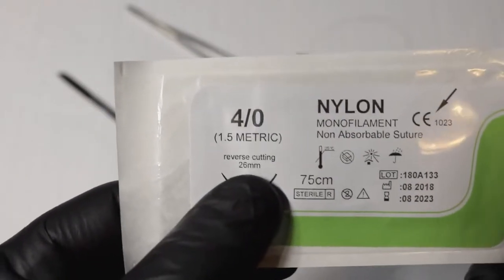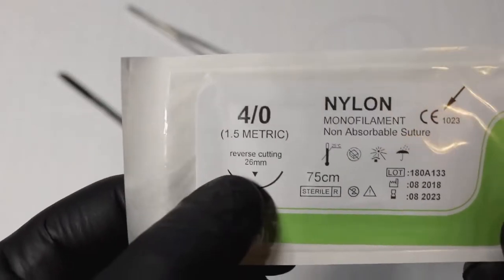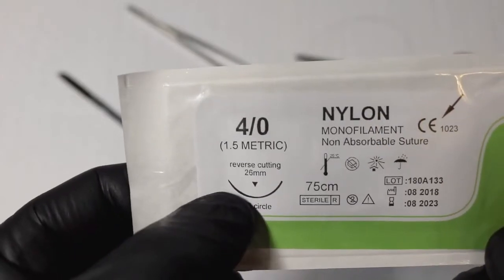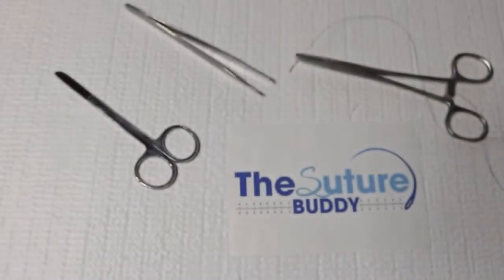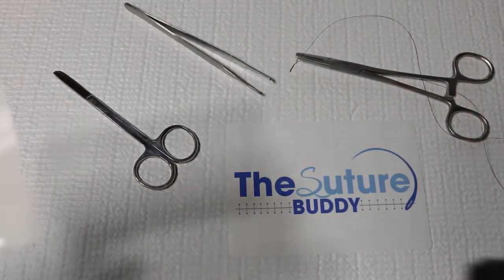Now let's talk about the actual needle itself. This is a cutting needle — you definitely want a cutting needle. There's also what's called a tapered needle. The cutting needle is going to pierce the skin, which is what you want. The tapered needle is more tapered at the end, won't pierce the skin as well, and is better suited for soft tissues.